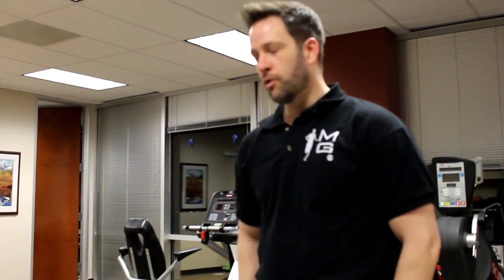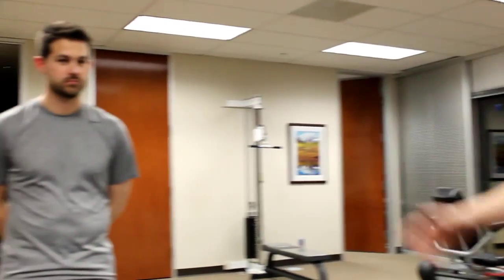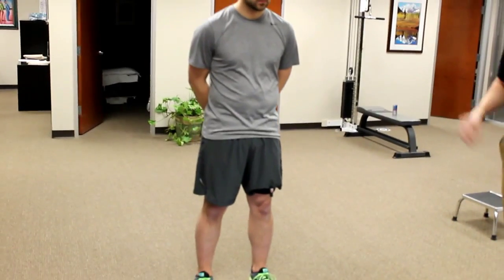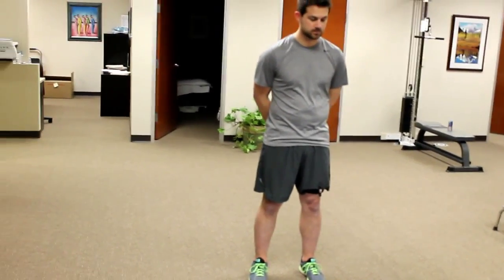Hi, this is Eric Dinkins, physical therapist with Motion Guidance. I wanted to take you through an assessment and treatment tool for knee quality of motion using the Motion Guidance device. Chris here has the Motion Guidance device applied to his knee on the left side, about an inch above the patella. We've turned on the laser and we're going to watch him squat.